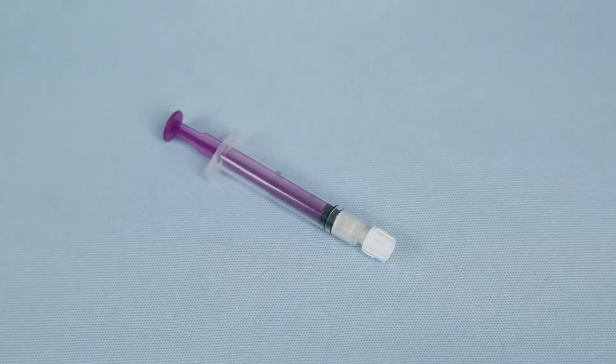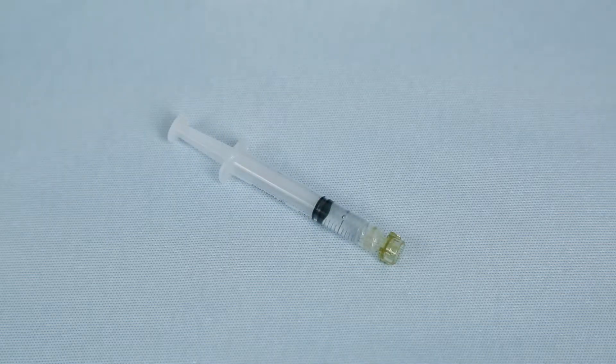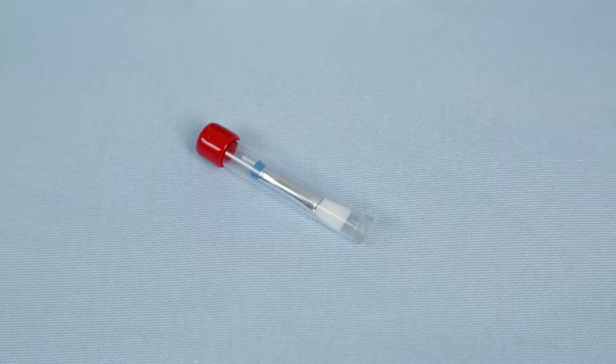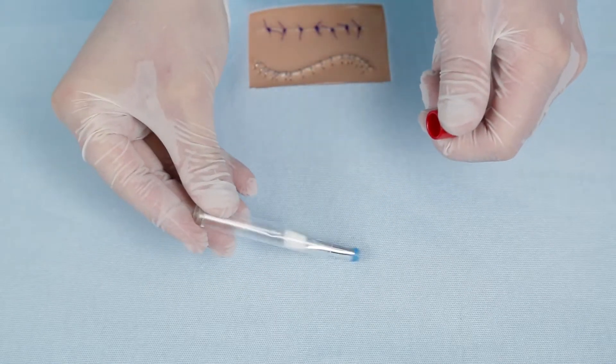One syringe is a 2.5 milliliter syringe containing 50 milligrams solid white powder hydrogel polymer and the other is a three milliliter syringe containing liquid phosphate buffer solution. Remove the sterile application brush from the brush case and have it ready for use.